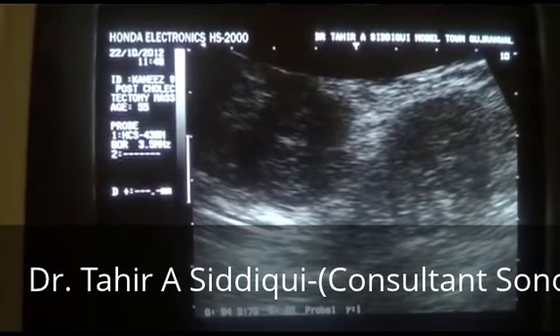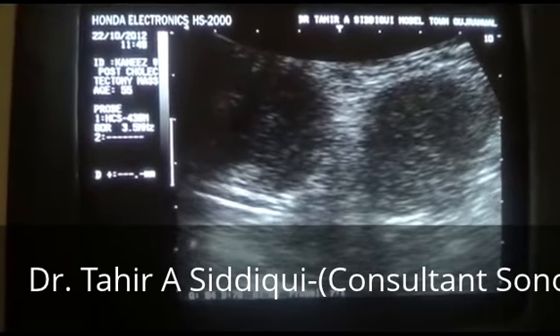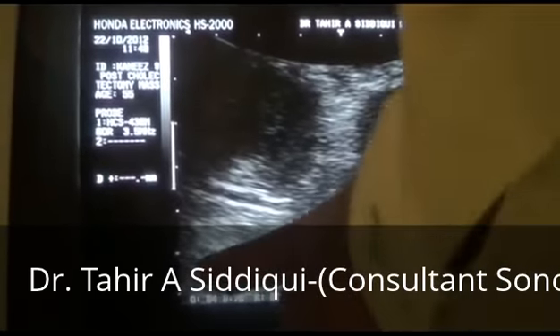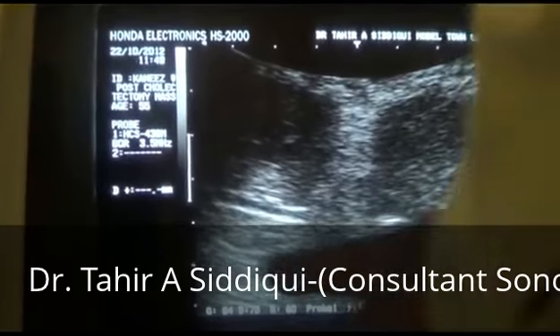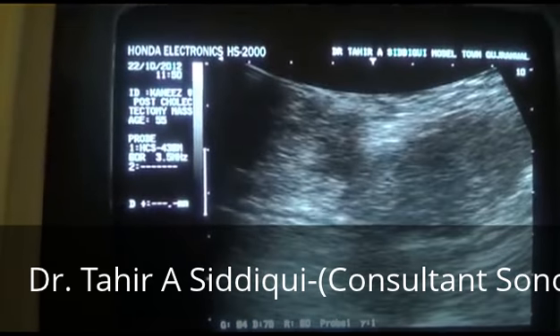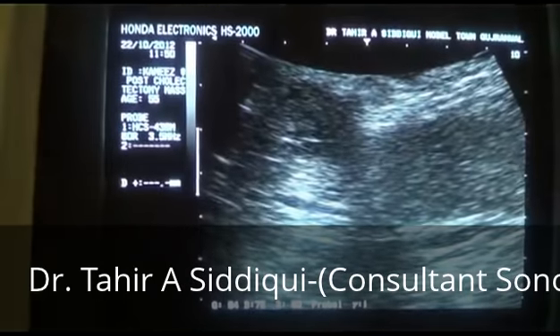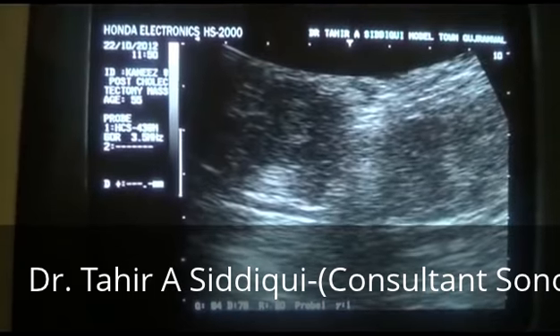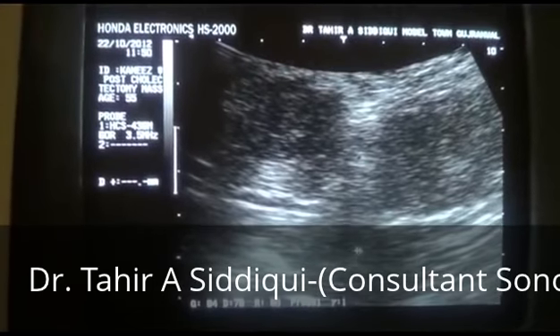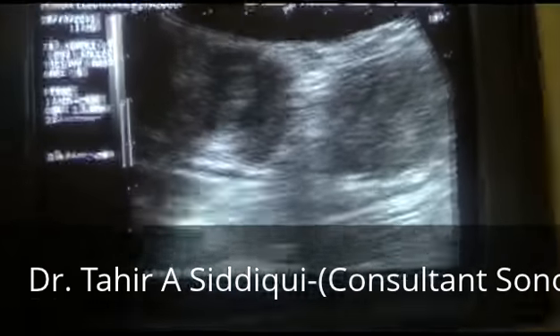With respiration, this area moves. This is the intraperitoneal region. Okay, now this is the peritoneal line. This line is the peritoneal line, and you can see movement in this area with respiration. There is no movement in the masses. They communicate with each other in this location. This is the intraperitoneal region where you can see bowel gases, etc. This line is that of the peritoneum.